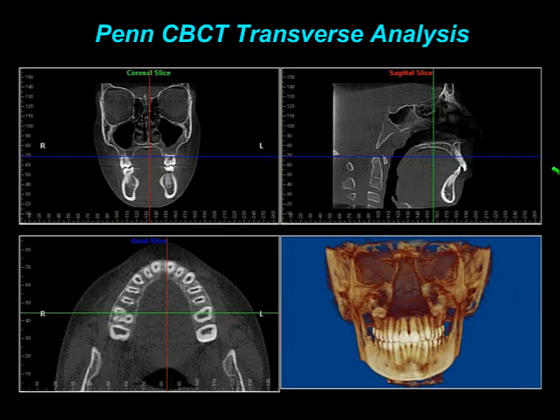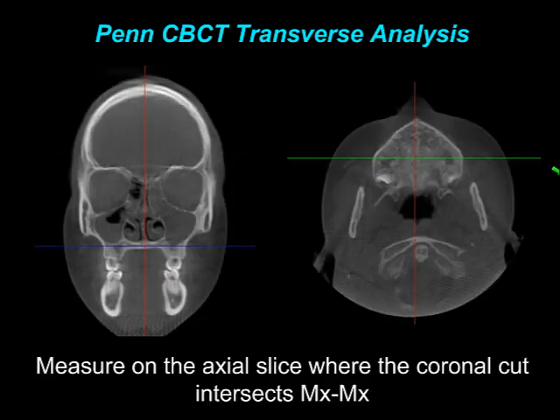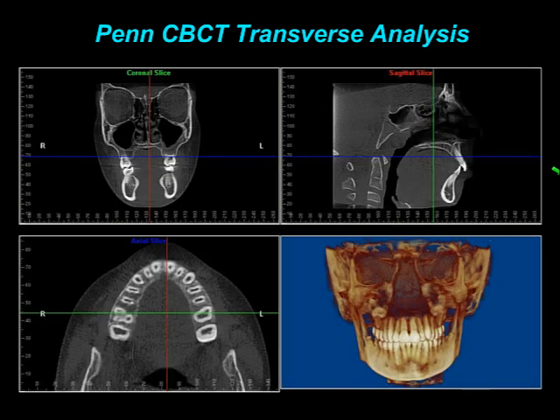So if we're looking at a cone beam of patients, we have to remember that with the cone beam imaging, we have the ability to look at a patient in 3 dimensions, and everything is going to be exactly 1-to-1. So I'm going to back up for 1 second. Now, the case that we're going to use for the example is of teeth upright, centered, and well intercuspated.